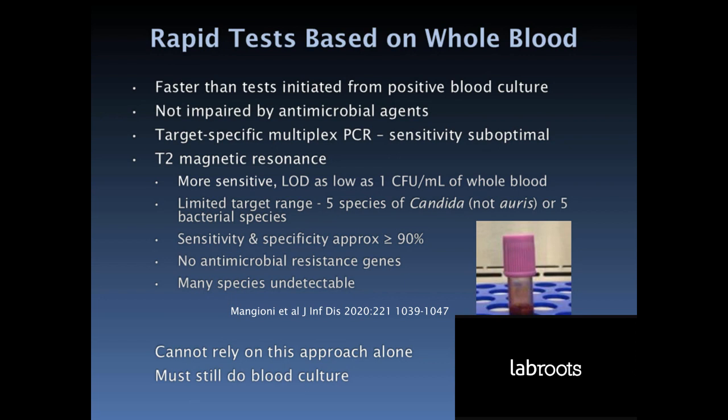But unfortunately, these tests are less sensitive than current multiplex PCR tests on positive blood cultures, and this makes them unreliable.